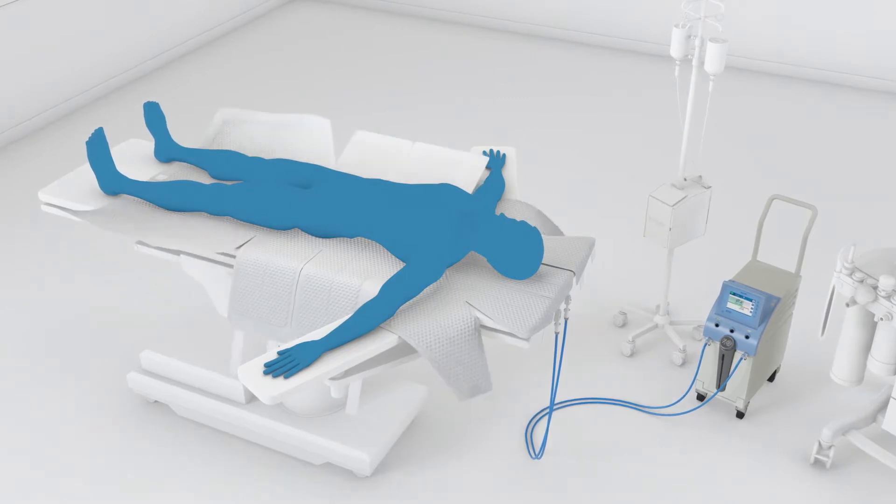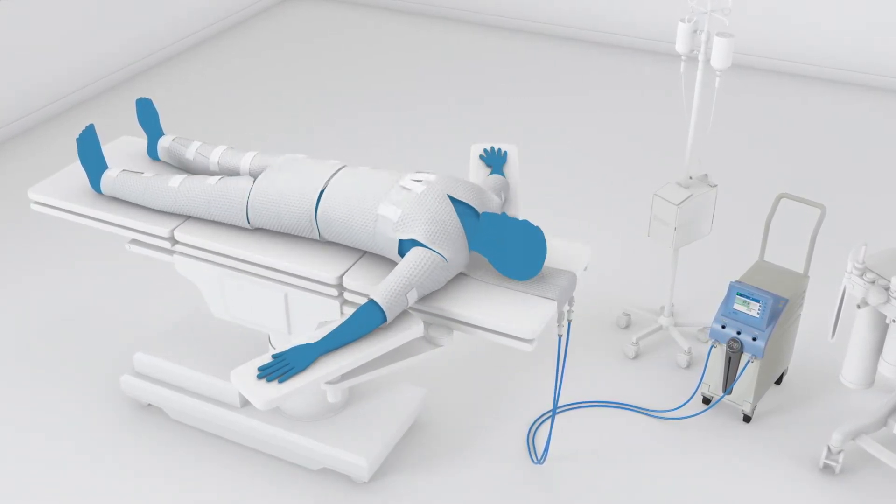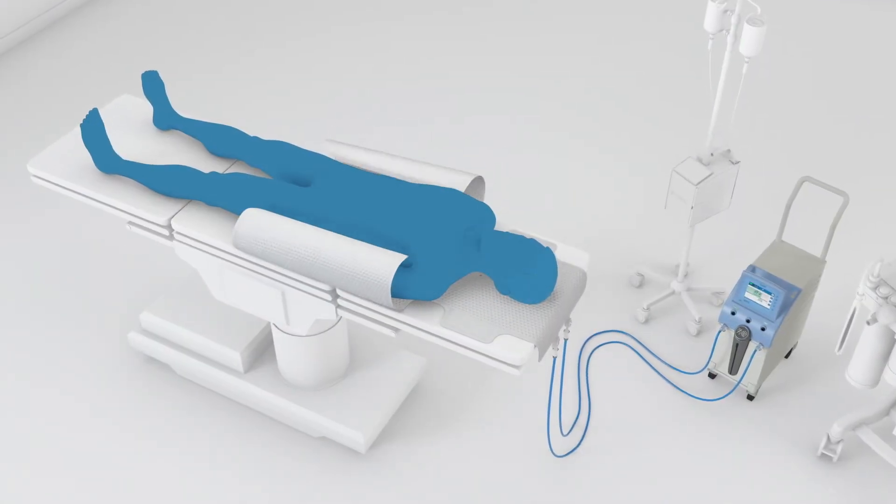It has uniquely designed body-shaped thermo-wrap garments that provide ideal body surface coverage and surgical access.